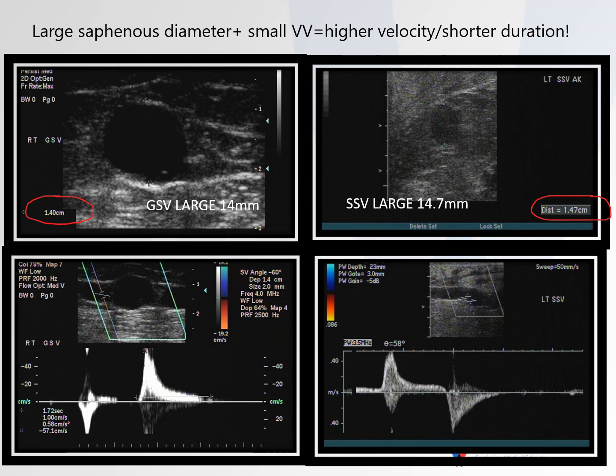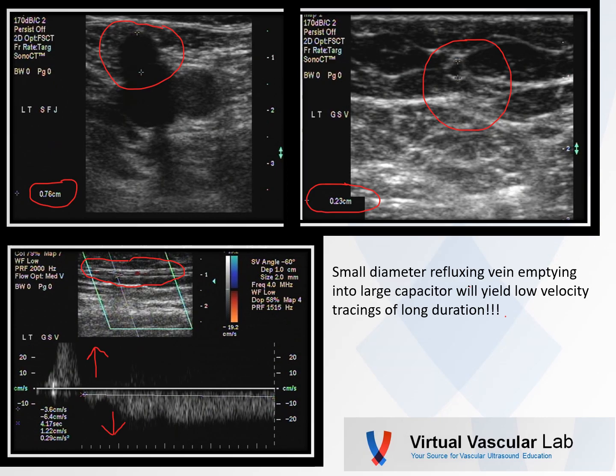Why would that be? Well, in both cases, if the vein is the reservoir and most of the blood is in the main trunk of that vessel and there aren't a lot of large varicosities in the leg, then you're not going to get the long duration times that you would get if you did have large varicosities. In both of these cases, these patients had large truncal veins with not very large varicosities.